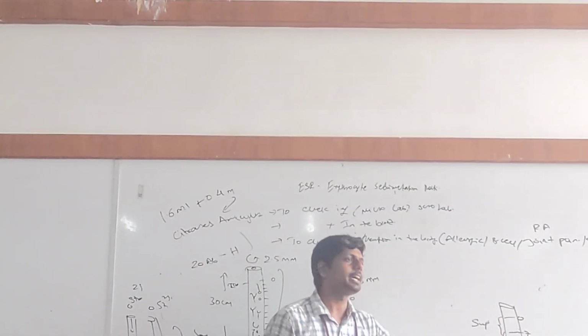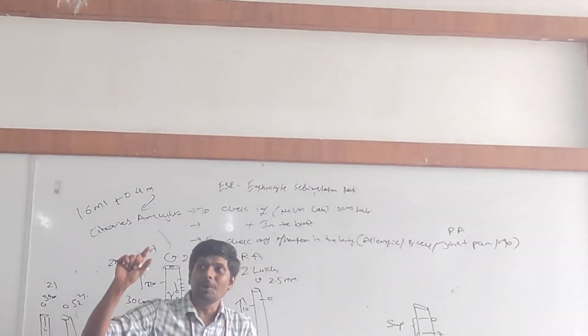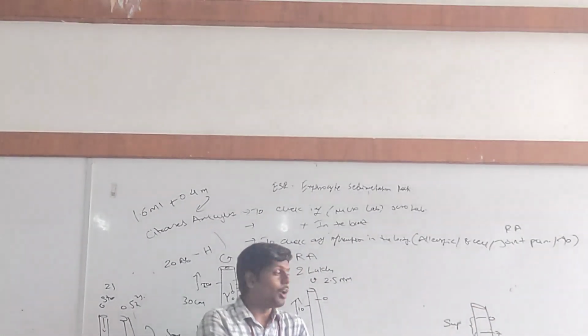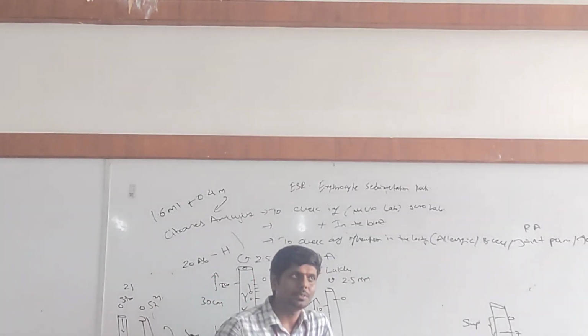The leftover will be the gap. We are not measuring this one. We are measuring this one. The supernatant gap will be measured in ESR, not the sediment. Keep in mind, this point is very important.